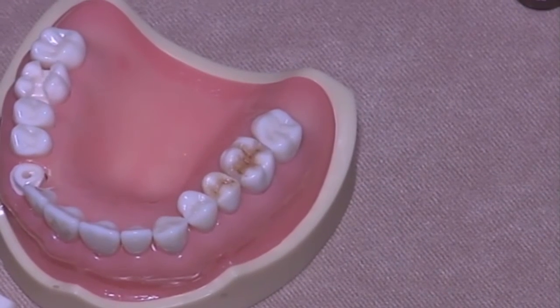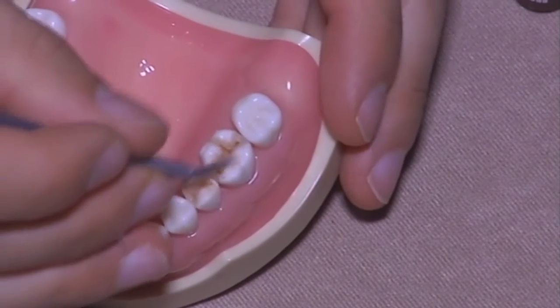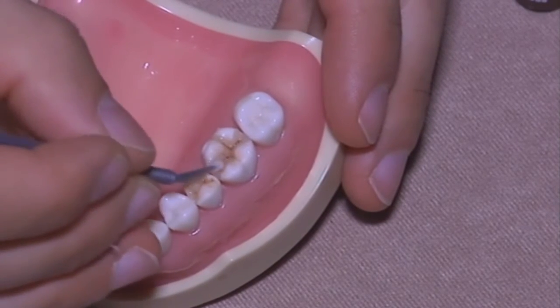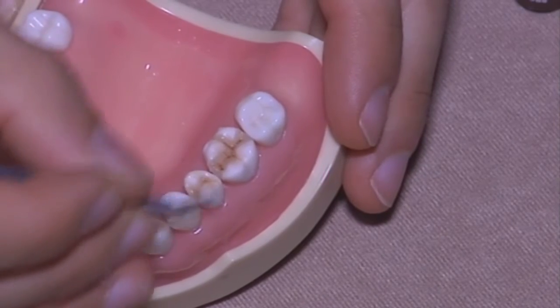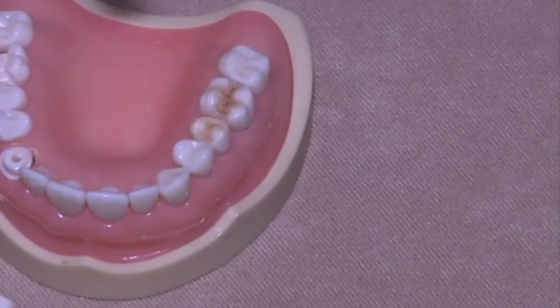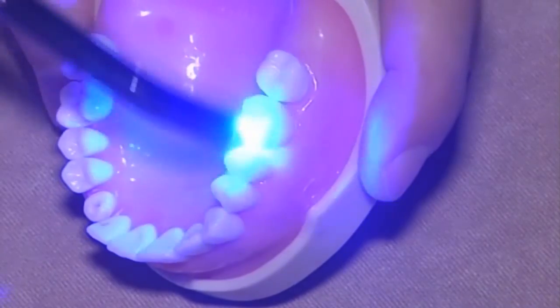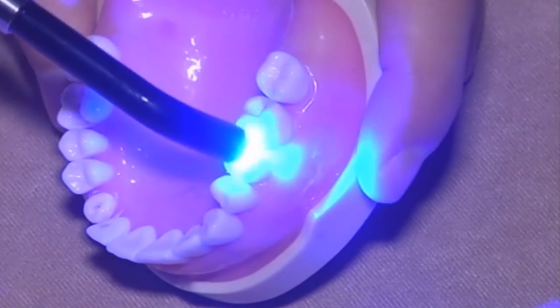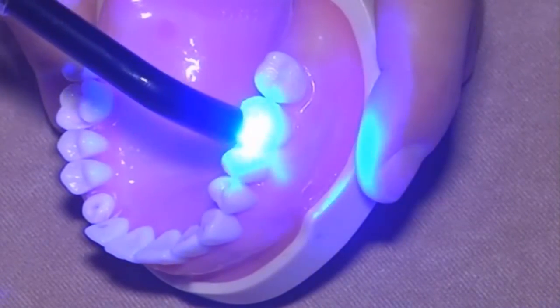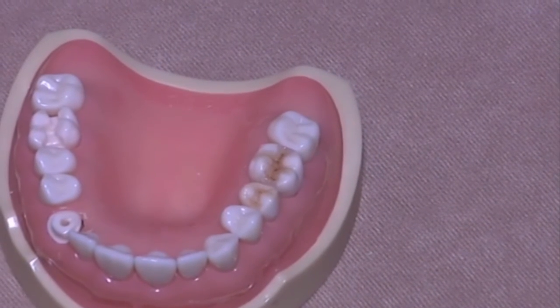Okay. As last layer, because this is the last layer, now we just miss to light cure for the last time, and then remember the OxyGuard, so the glycerin gel, to avoid the dispersed phase of the composite, which is the oxygen inhibited layer. And then we move to the finishing procedure.